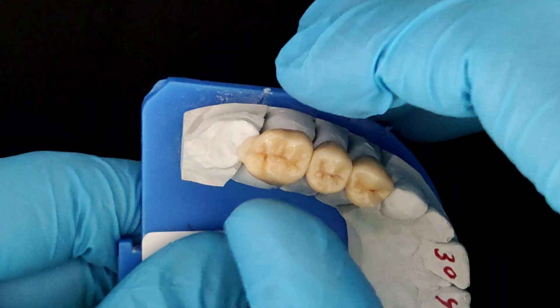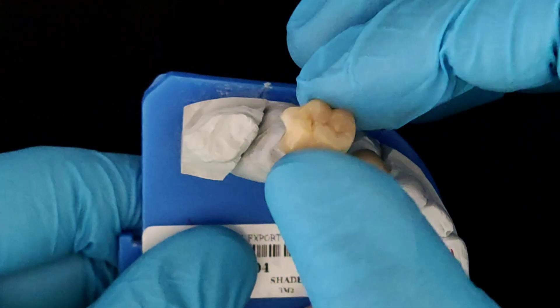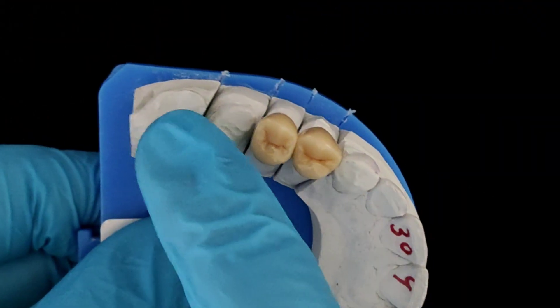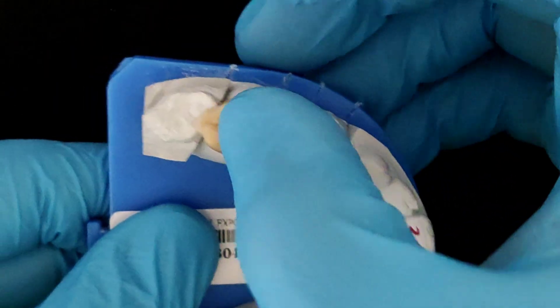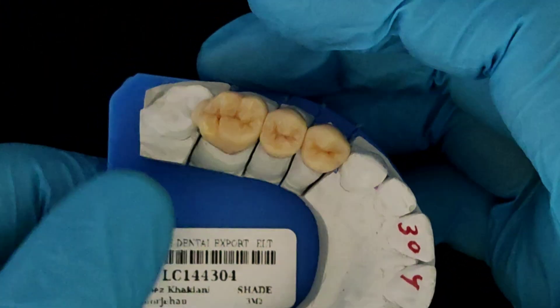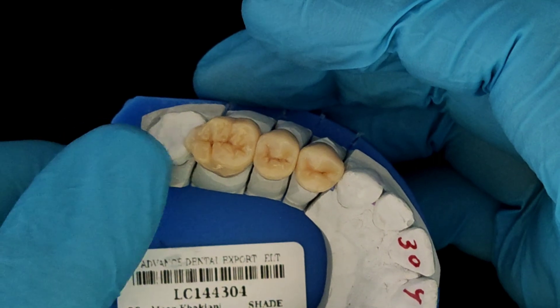Let me show this from the occlusal perspective. This is the first molar with a small extension. Remember, there is no preparation done on the seven — just this extension of the restoration that basically prevents the upper seven from supra-erupting.